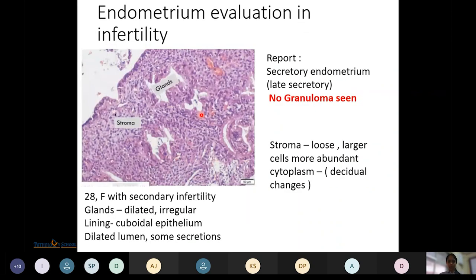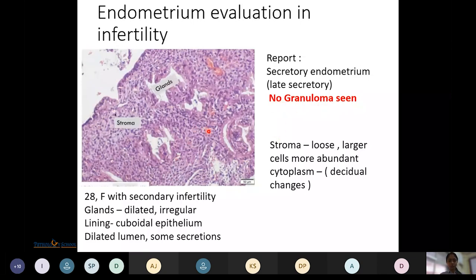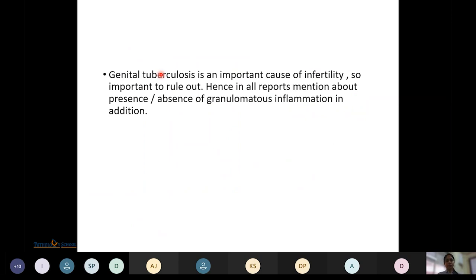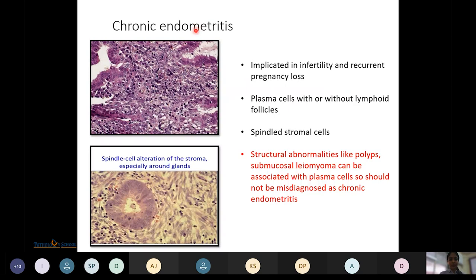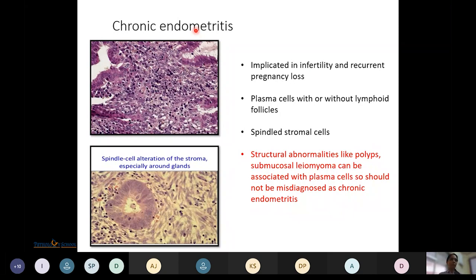In reporting secretory endometrium, it is important to mention whether granulomas are seen or not, because in our country genital tuberculosis is one of the leading causes of infertility. The stroma appearing loose with larger cells and more abundant cytoplasm indicates decidual change. Chronic endometritis is a cause of infertility and recurrent pregnancy loss; plasma cells with or without lymphoid follicles and spindle stromal cells are seen, particularly around glands. Structural abnormalities like polyps and submucosal leiomyoma can be associated with plasma cells and should not be misdiagnosed as chronic endometritis.